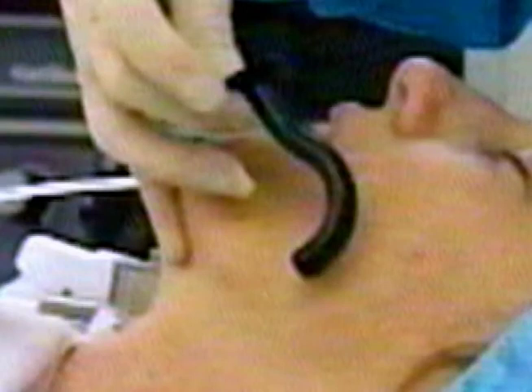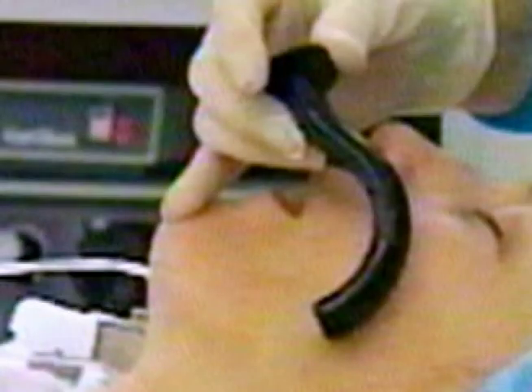To estimate the correct size, place the oral airway next to the patient's jaw and judge where the tip will lie. Too short pushes the tongue back over the larynx, worsening airway obstruction. Too long extends outside the mouth and interferes with mask fit.